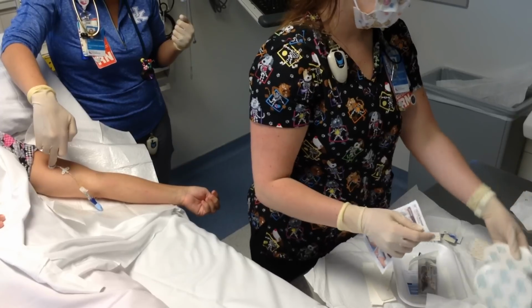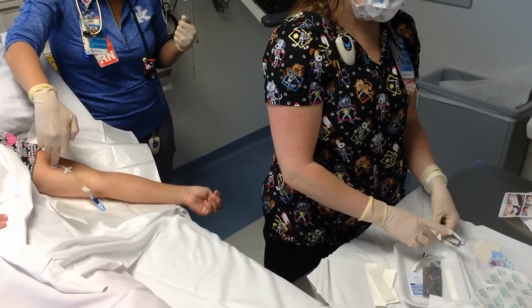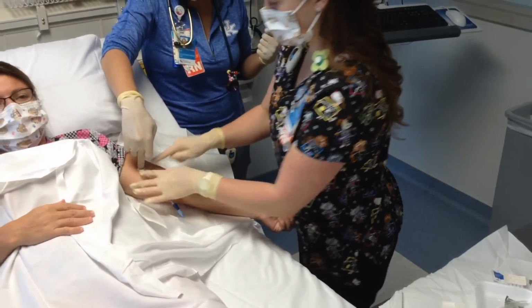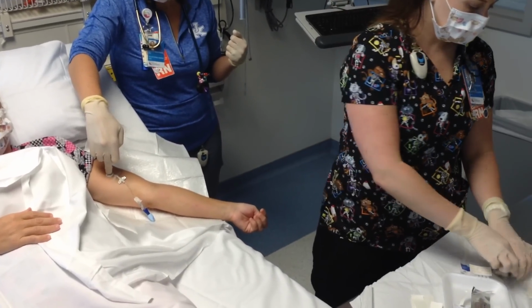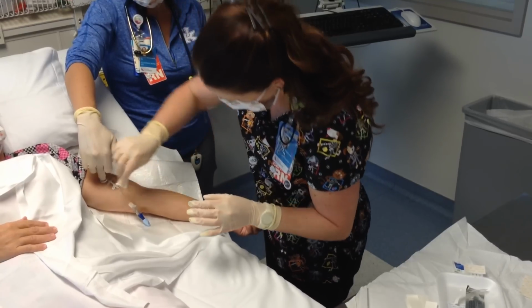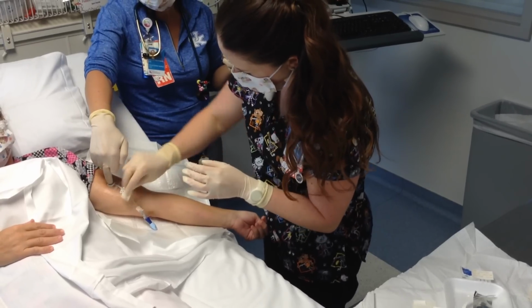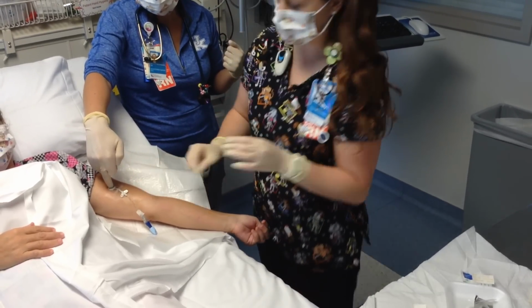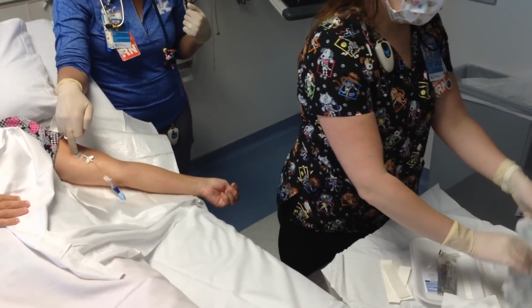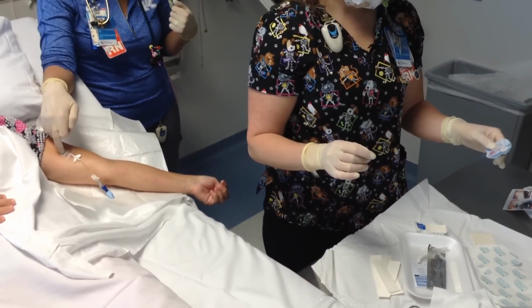Now you're going to apply steri-strips. Do not apply over the insertion site. Steri-strips must be inside the dressing. Then you want to apply your skin prep. Apply skin prep to skin area that will come in contact with the securement device and transparent dressing. Allow to air dry. Do not apply the skin prep to the insertion site. Then once your skin prep dries, you want to apply your 3M dressing.